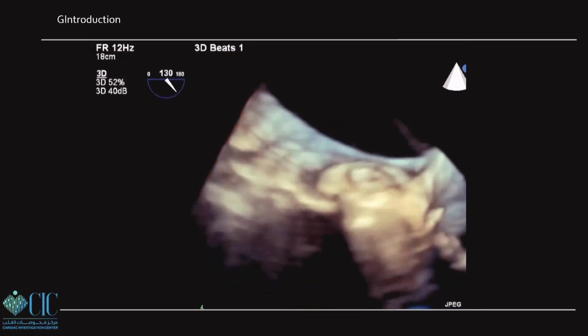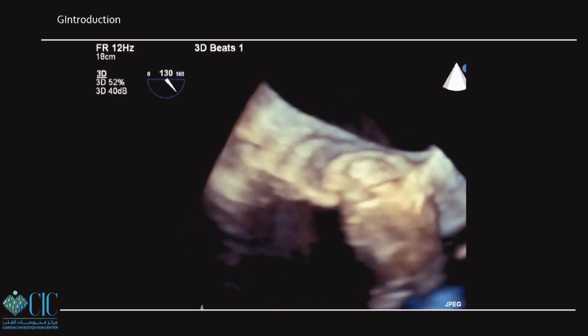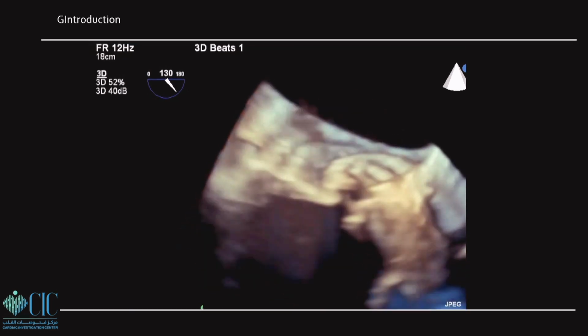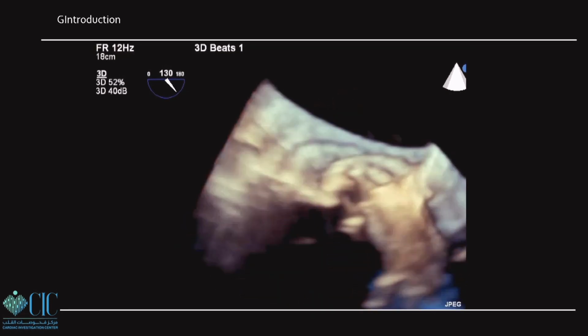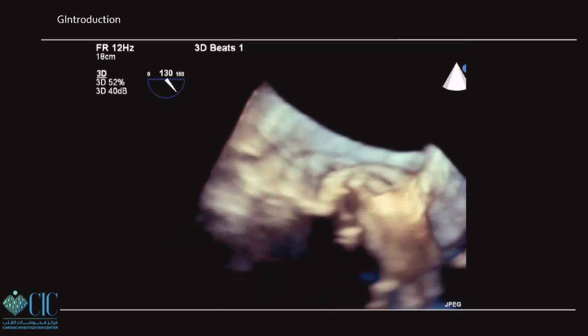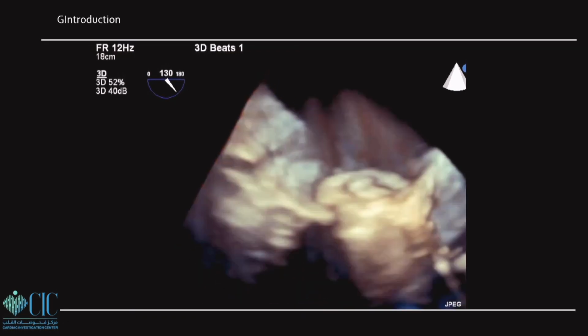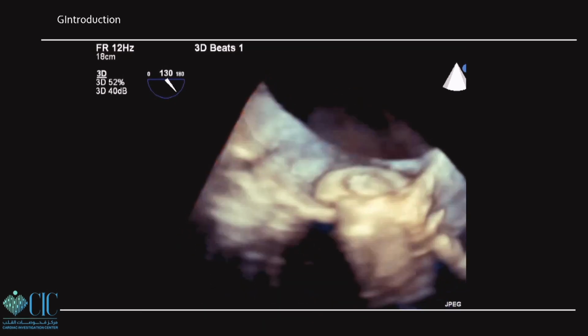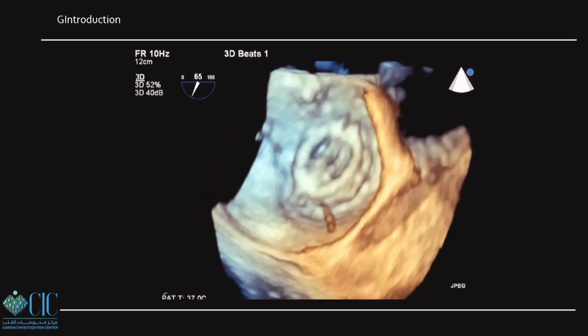The discs, and it will impair the motion. I don't care about the defect, even if I close the defect fully, but the valve is not working, so what's the benefit? We tried first, at the beginning of our experience, to close this defect, and we never won. Usually we get caught in the discs and then deploy or try to get away from the discs with smaller plugs, and then we have residual leak. So my advice, don't try in these kind of defects.